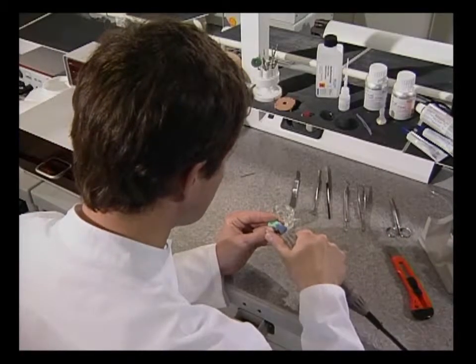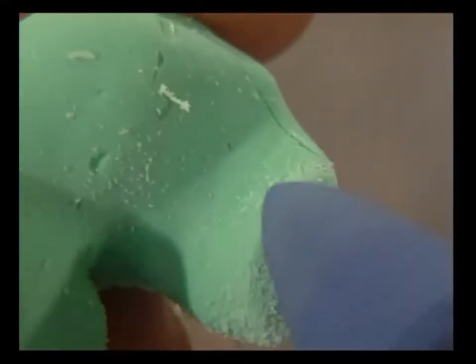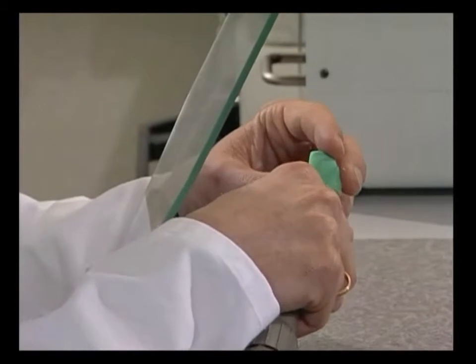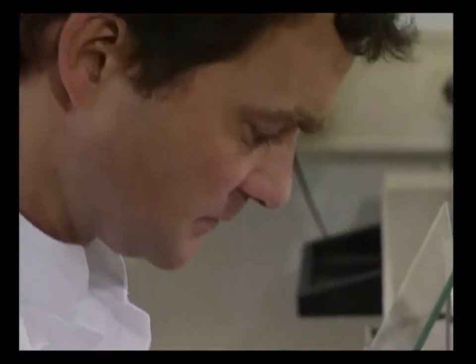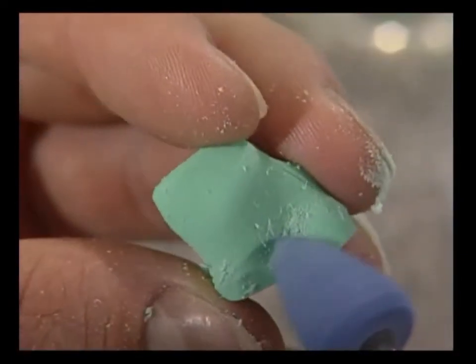If the auditory canal has a pronounced conical course, it should be carefully removed in this area with a pear-shaped or pointed trimmer to simplify the insertion of the finished shell into the wearer's ear. Sharp edges and trims are then removed from the impression.